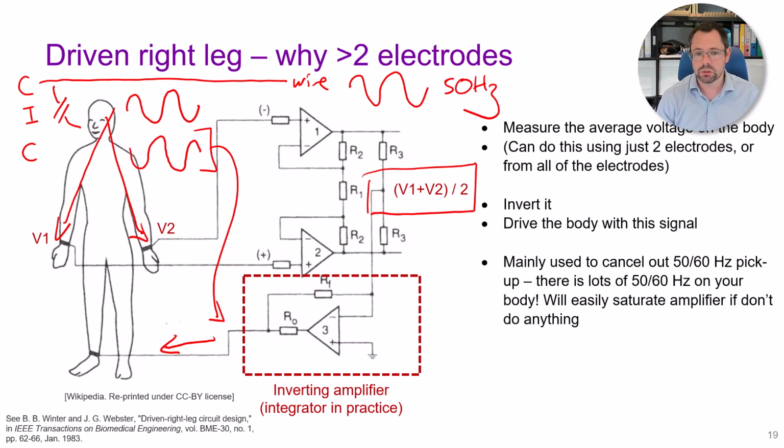As a result, the interference is cancelled out, letting us record the signals that we want. If you're coming from an electronics background, this is a very classical closed loop control situation, the sort of thing that electronic engineers would learn about in a graduate course.